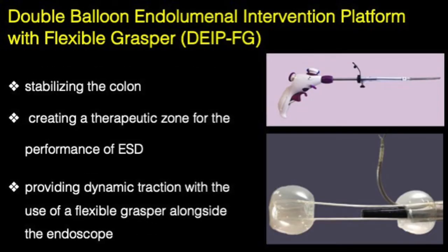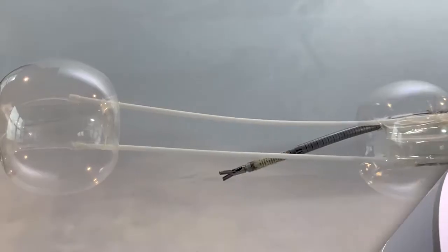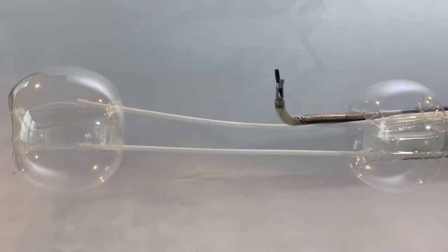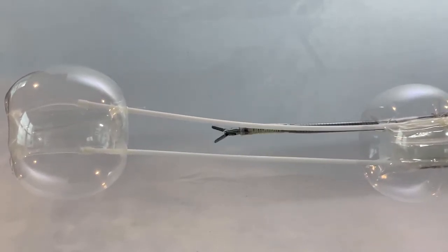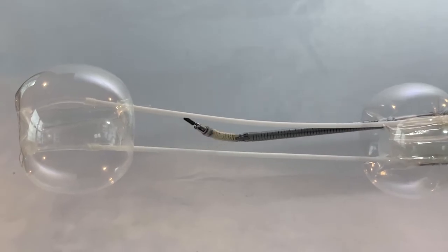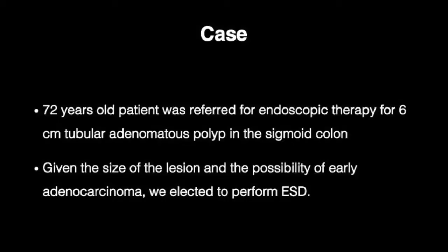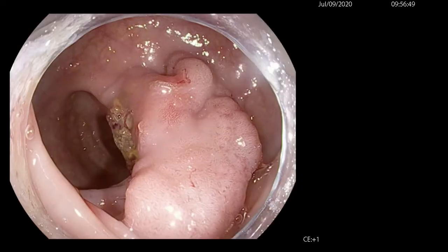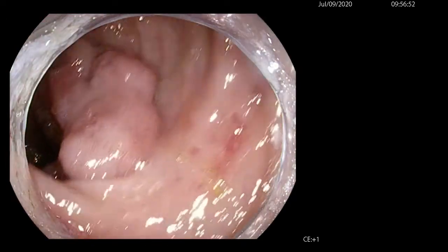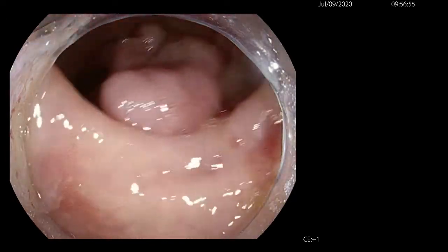In this video, we describe a double-balloon endoluminal intervention platform with a flexible grasper, which allows stabilization of the colon, creating a therapeutic zone for the performance of ESD, and provides dynamic traction with the use of a flexible grasper alongside the endoscope. Our patient was a 72-year-old referred for endoscopic submucosal dissection of a 6 cm tubular adenomatous polyp in the sigmoid colon. Given the size of the lesion and the possibility of early adenocarcinoma, we elected to do ESD. We demonstrate the usefulness of this novel technique in the removal of this 6 cm polyp.